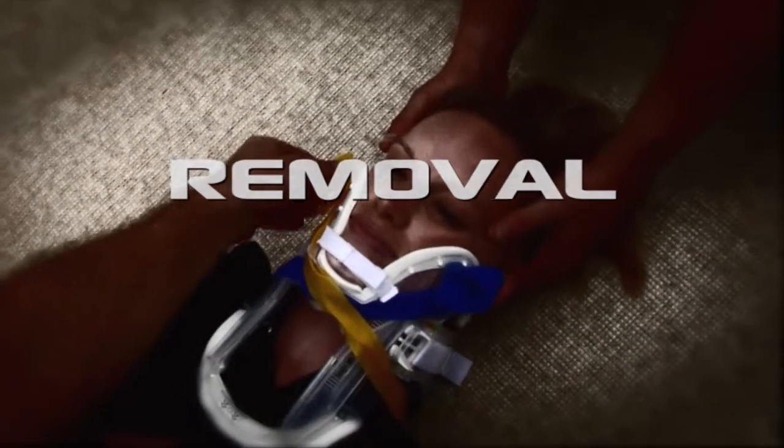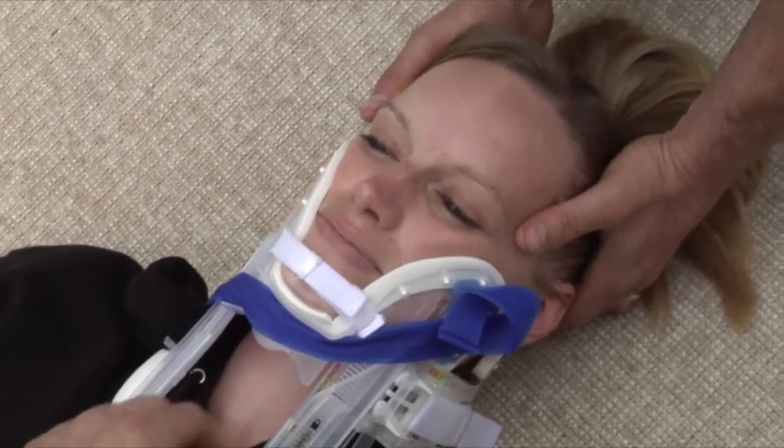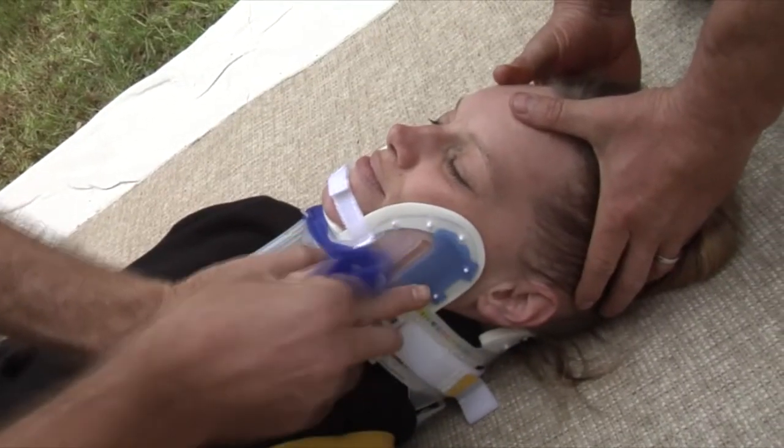X-Collar Removal. First, release each X-Strap in a controlled manner to eliminate rapid expansion of the X-Collar.